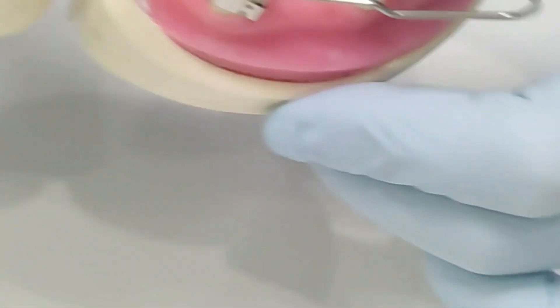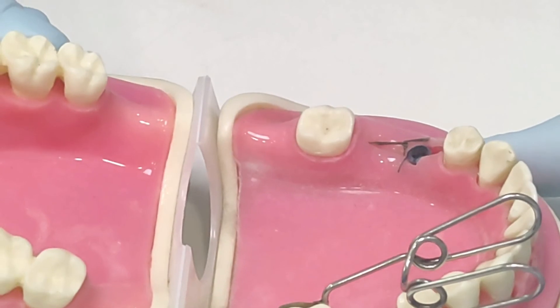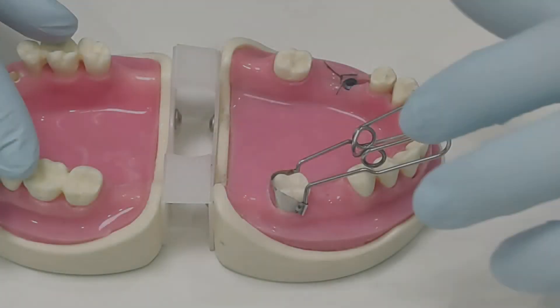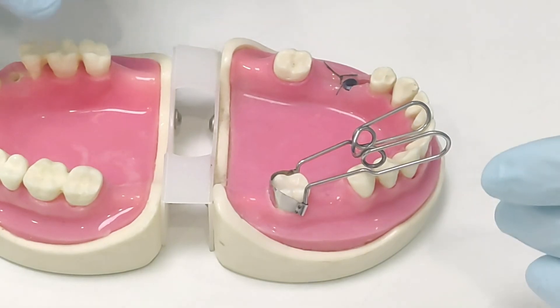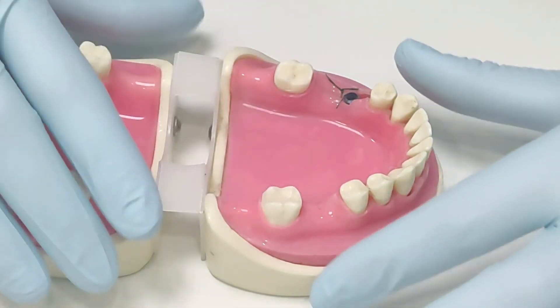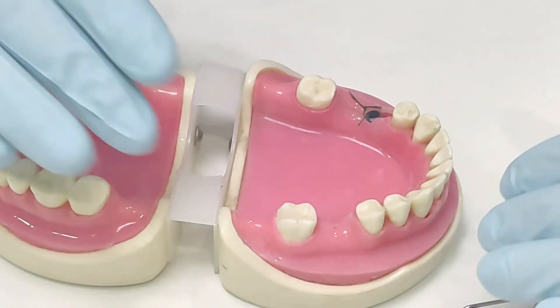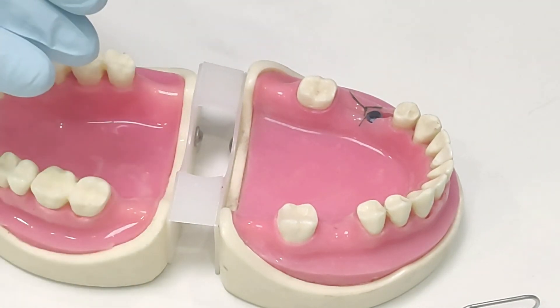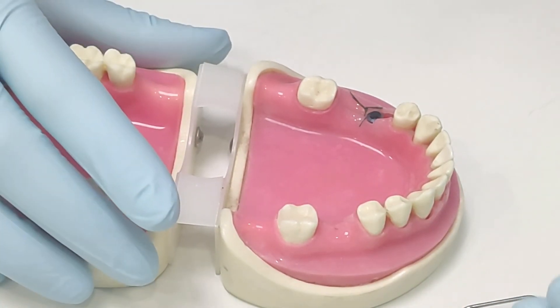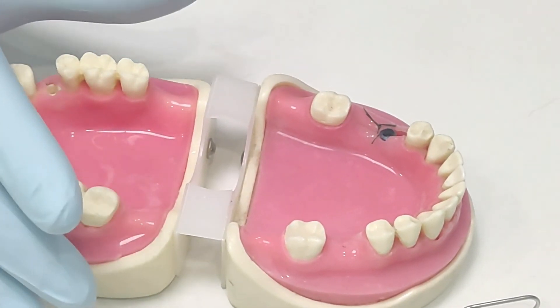As you can see, the cavity is all filled. The next step would be polishing and finishing. In a matter of a few minutes we are done with our restoration. We just need to do a bit of finishing and polishing, and then we're done — the patient is ready to go. The patient is happy and the clinician is happy, because of the fracture resistance, the adaptability, and the incredible handling properties of both composites: EverX Flow as well as Solare X.